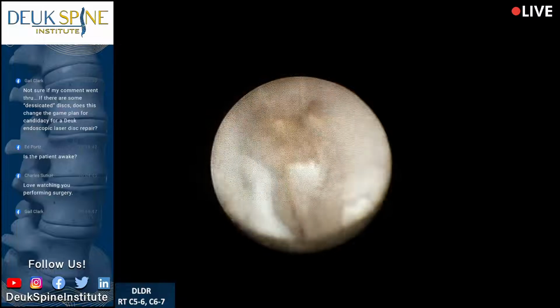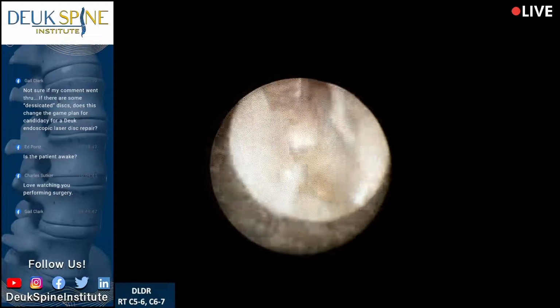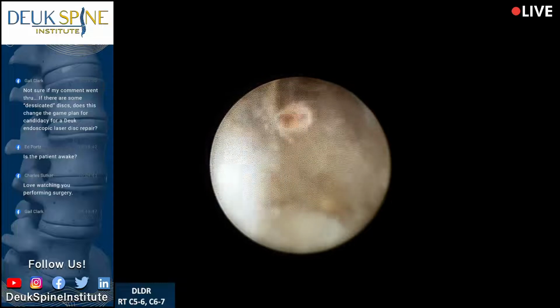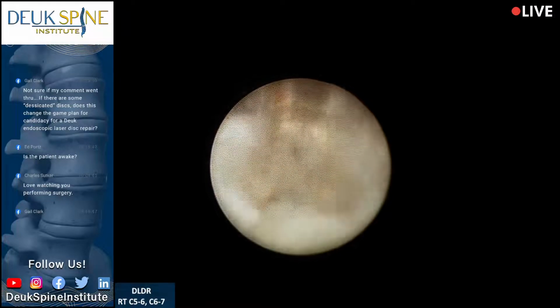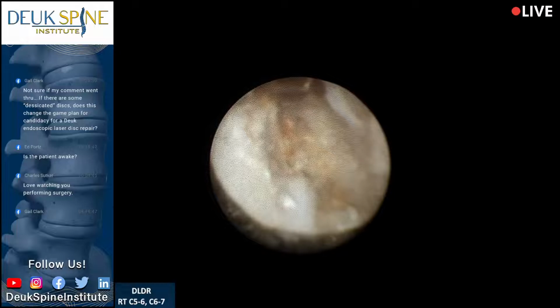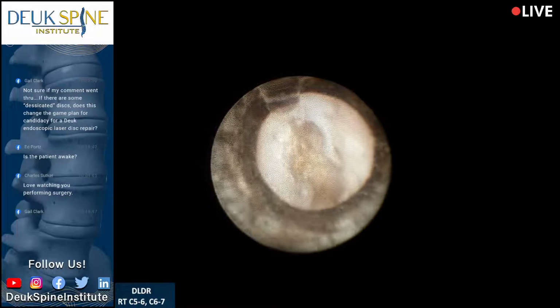That's why you see calcification of the tissue. It's really from chronic inflammation that brings on these little bone spurs, like the one I'm working on. And that calcification process is your body's way of trying to heal. Nobody understands why it happens.